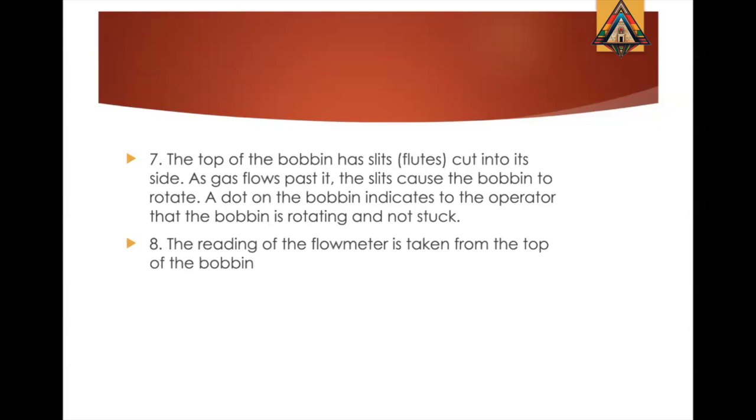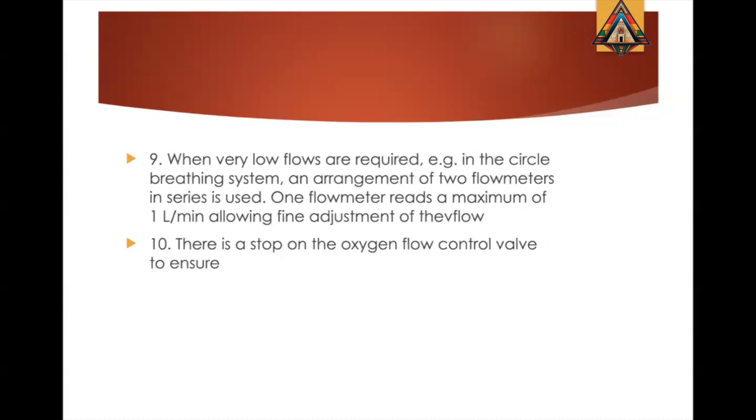The bobbin in the tube usually rotates. It may get stuck in case there's static electricity, but that's a dysfunction. It needs to be rotating. And always read it from the top end of the bobbin.